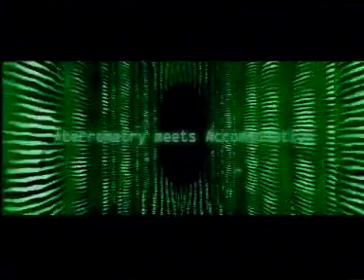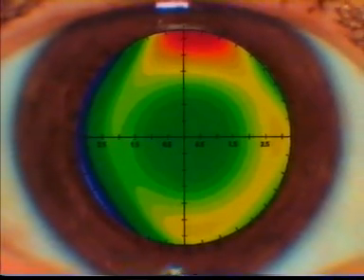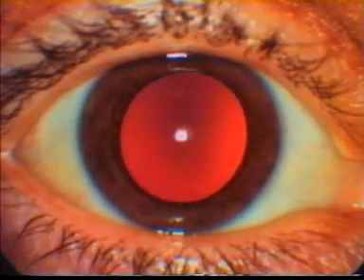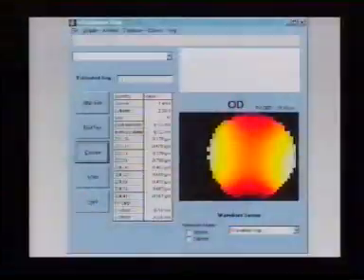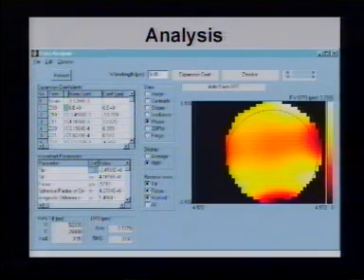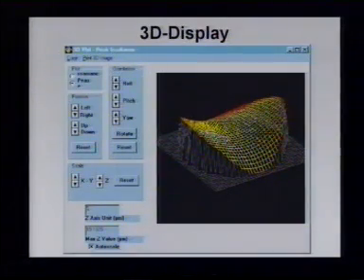Wavefront sensing helps us to understand the complexities of refractive surgery. We are now able to evaluate and measure the entire optical system of the eye. The wavefront map demonstrates the outgoing wavefront over the pupil with the ideal wavefront printed green. The map represents the wavefront at the time point of one measurement, but short-acting factors like tear film, vitreous floaters or accommodation influence the highly sensitive measurement to a marked extent.